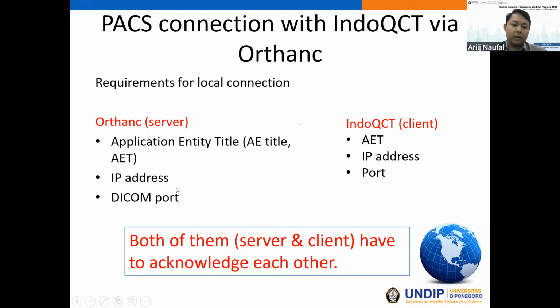Orthanc also requires a DICOM port, and IndoQCT requires a port. The port here is different from the DICOM port for the local Orthanc server. And both of this information has to be added or registered for each other. So both the server and the client have to acknowledge each other in the settings or in the registration.